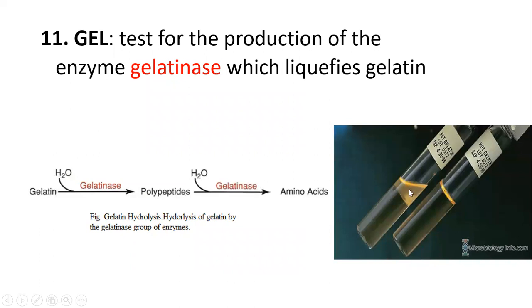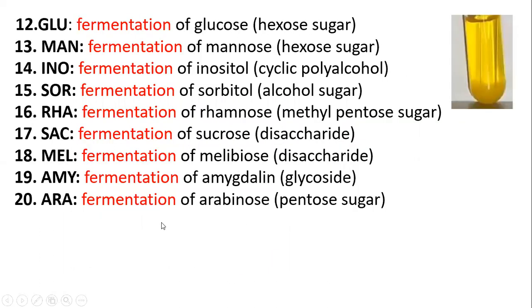So this one is the negative test, and this is the positive test. After that, these are all the rest, from 12 to 20. These all are the fermentation reactions.